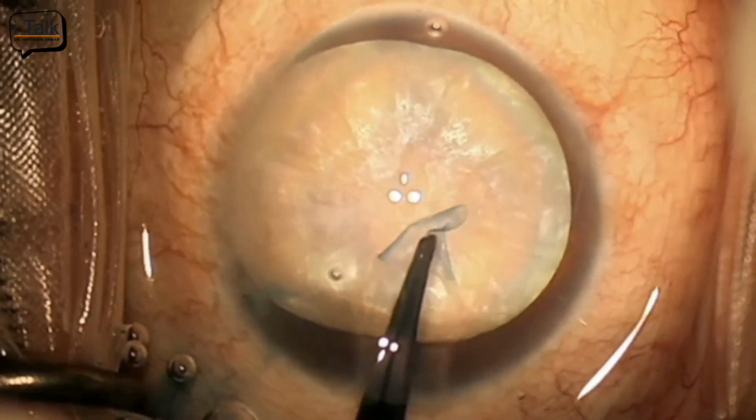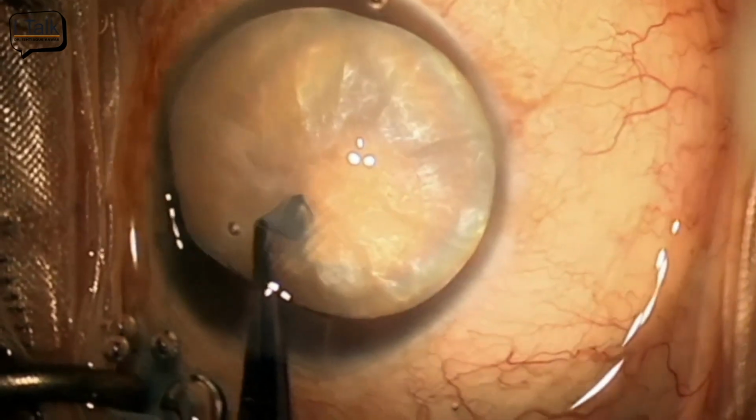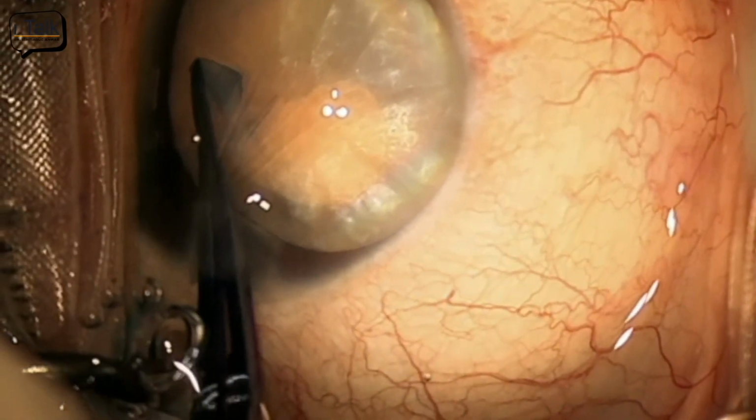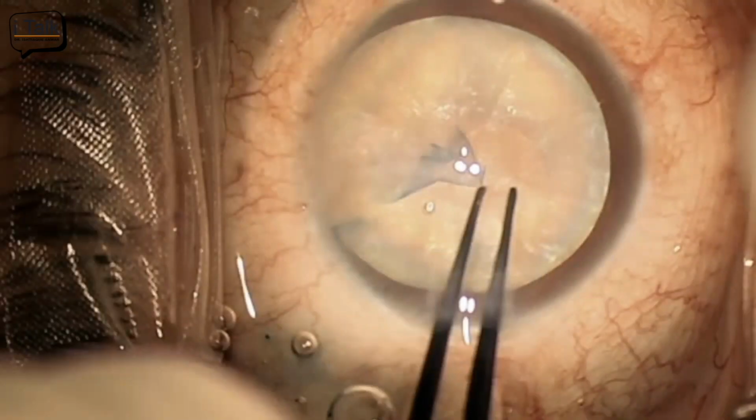And third, if you find, while I'm trying to create a rhexis flap, there's a mismatch between the incision size and the forceps which I'm using. So which was causing the OVD to egress out, and ultimately it created a situation in which the flap went out of control and there was a rhexis there.